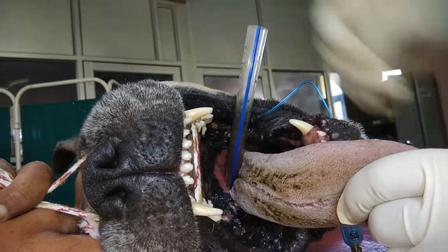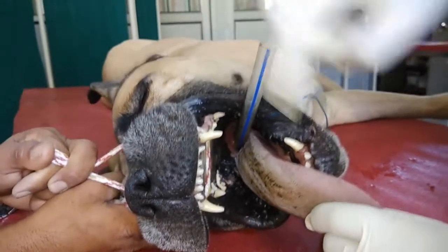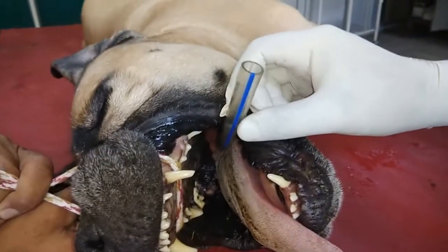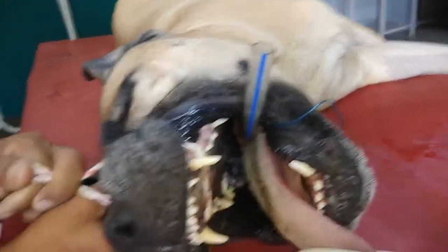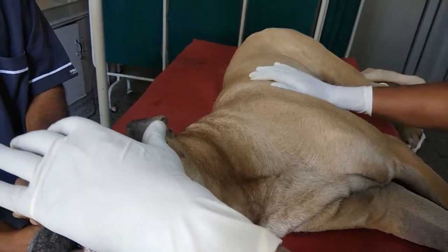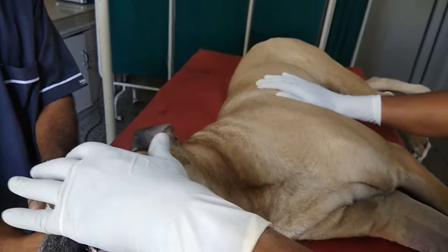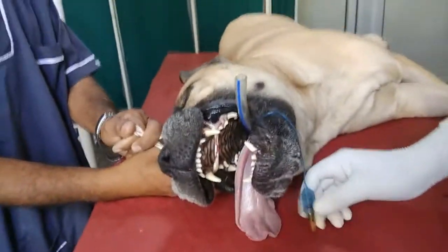The esophagus is basically dorsal to the trachea, so whenever the tube goes into the esophagus, the position of the endotracheal tube would not look like this. For confirmation, press the chest and you can feel expiration — you can feel air coming through the tube.